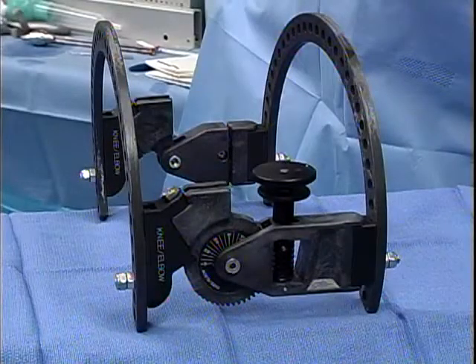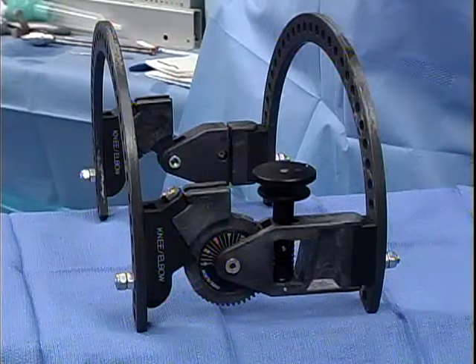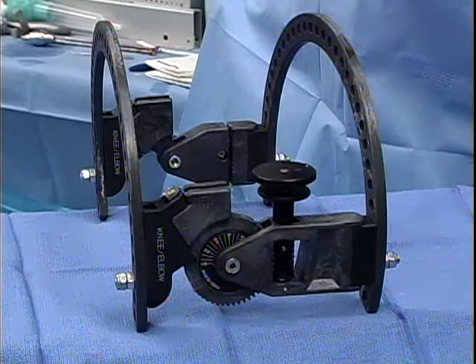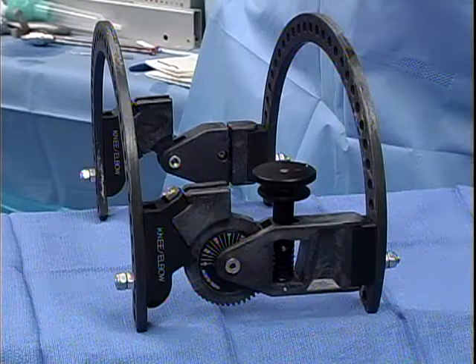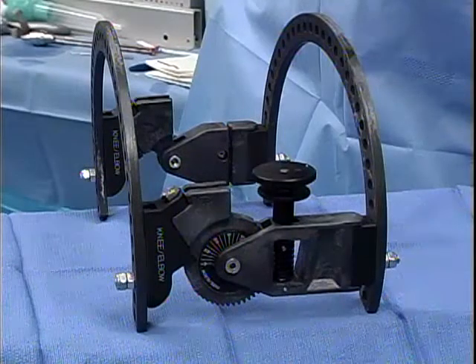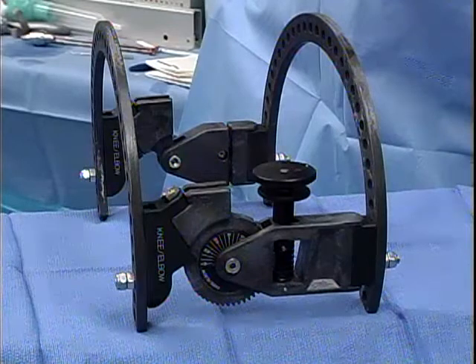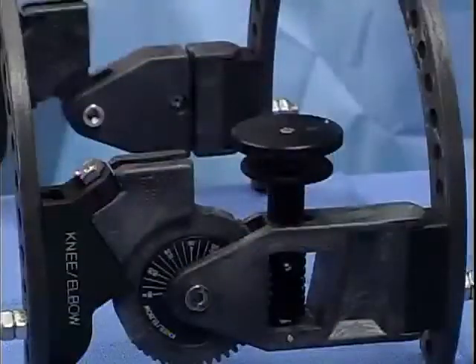The compass knee hinge is a device modified from the original compass elbow hinge for the treatment of complex injuries about the knee. Potential indications include knee dislocations, fracture dislocations, complex tibial plateau fractures where conventional implants don't provide adequate stability for early knee motion, and flexion contractures not responsive to manipulations and arthroscopic lysis of adhesions.